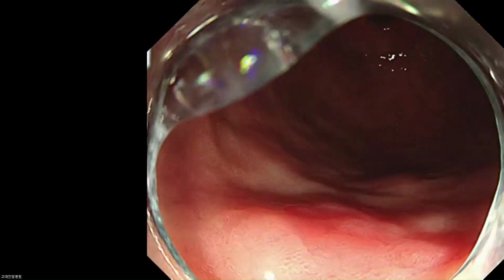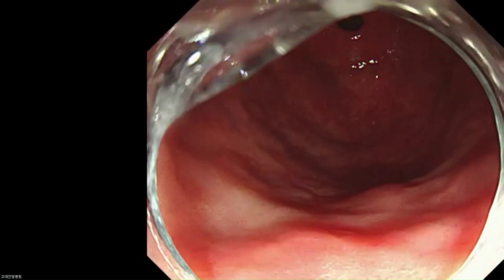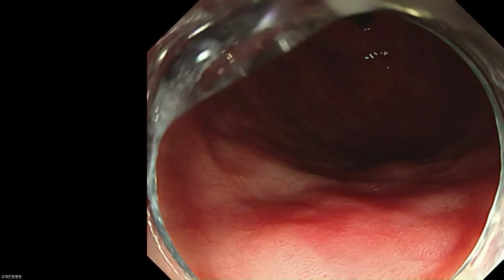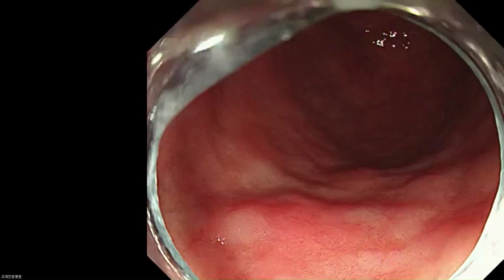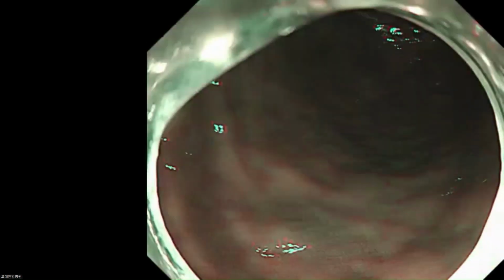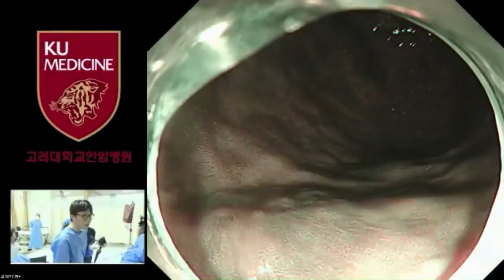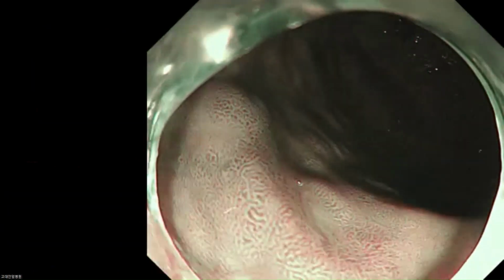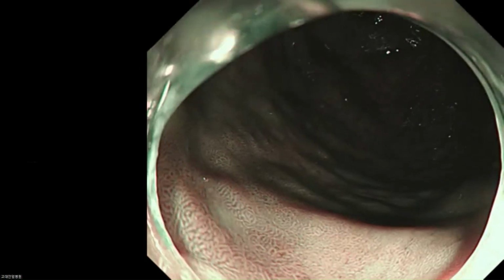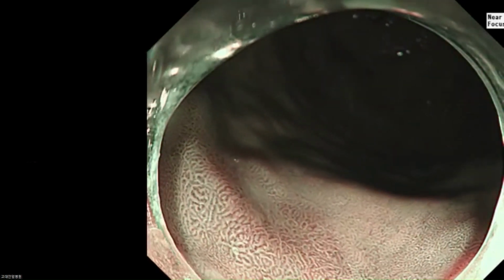In white light image, you can see the slightly elevated lesion with central depression at the anterior wall of the antrum. I'll change to the NBI image. As you can see, we can see this neoplastic lesion at the anterior side of the antrum. I changed to the near focus NBI view.